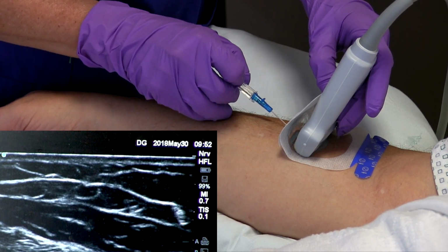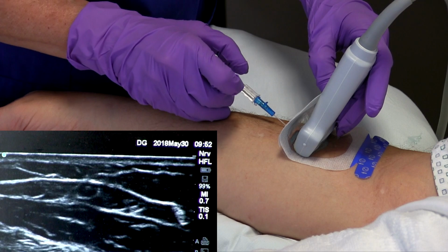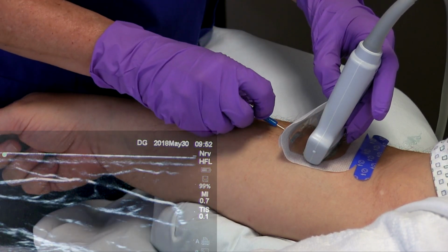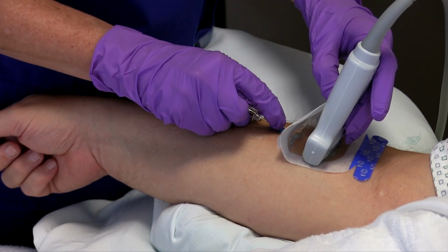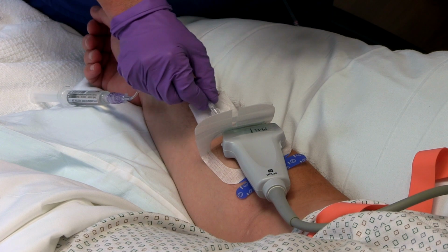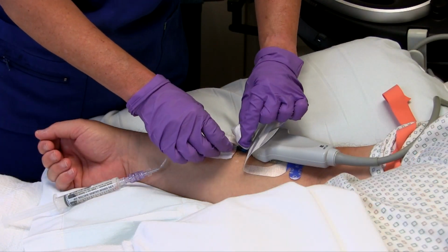Insert the intravenous catheter using ultrasound to guide the needle and catheter into the vein. Achieve your blood return and advance the catheter into the vein, completing the extension tubing attachment, flushing, and securement method as needed.